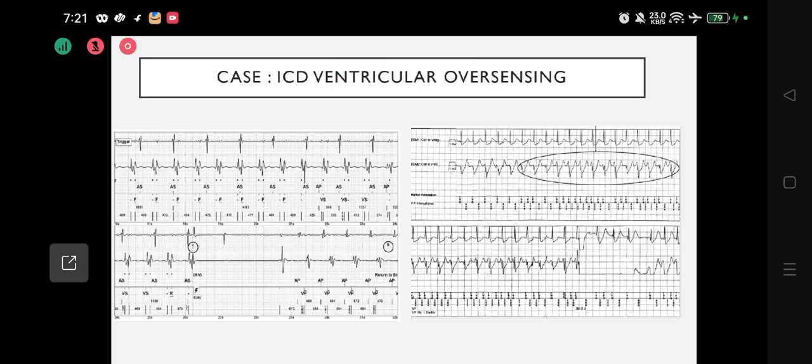What has happened? For the sake of clarity, because people need a little more training, on the right side where your arrow was, we will go one by one to all the tracings. For example, CAN to ring. First I'll explain, then we'll get back to them with some old examples. I just want them to learn this much. Yes, this is ICD troubleshooting. That's good enough: EMI, lead noise. There is nothing else.